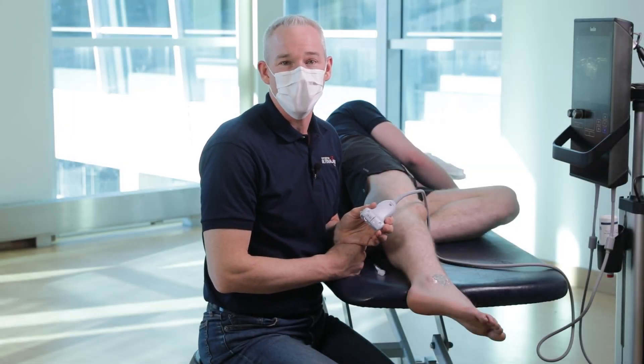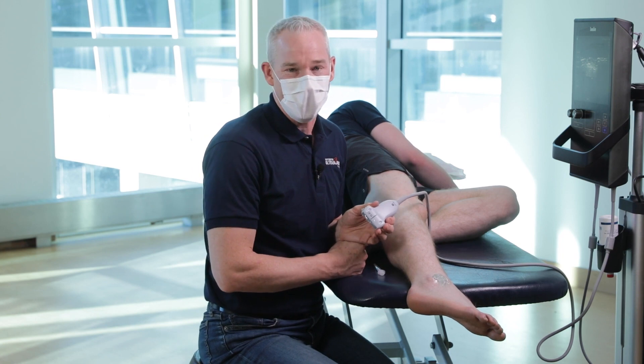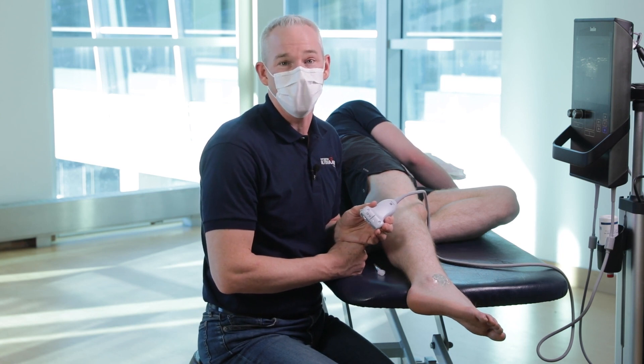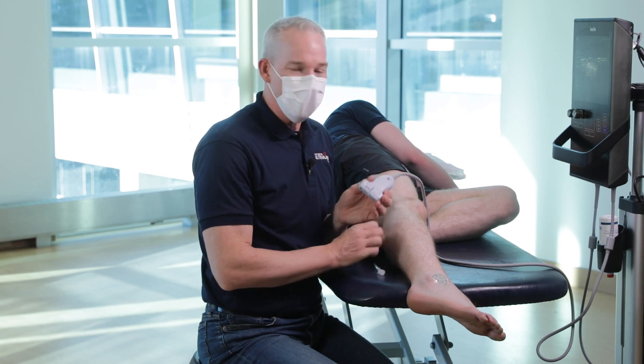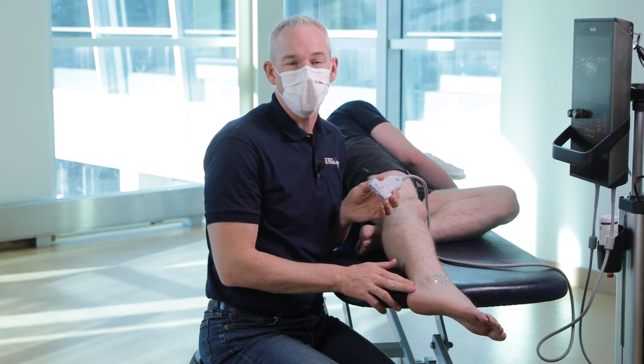Dr. Frank Johnson with Sport Medicine Ultrasound Canada. I'm going to show you how to scan and inject the ATFL on the lateral ankle. For this, the patient position should be side lying with the heel hanging off the table.